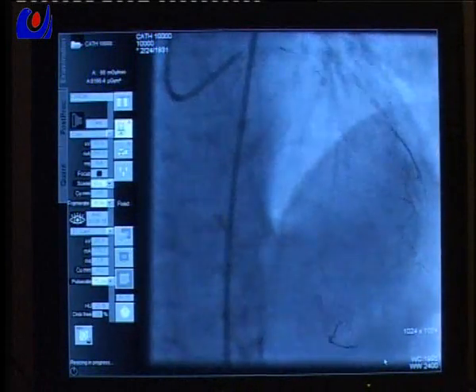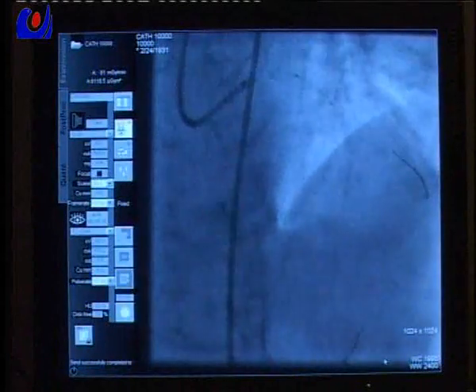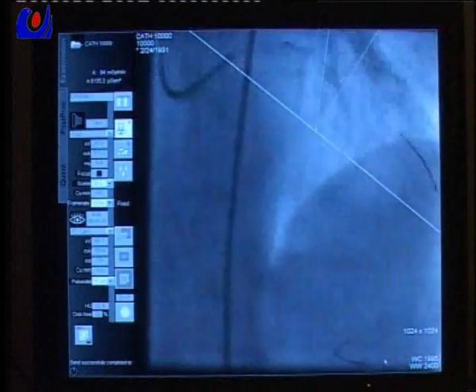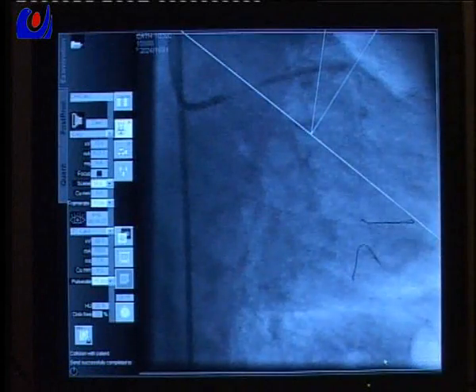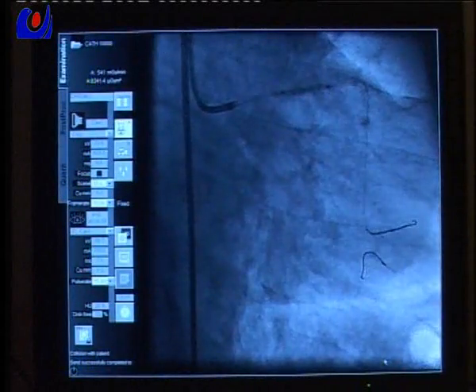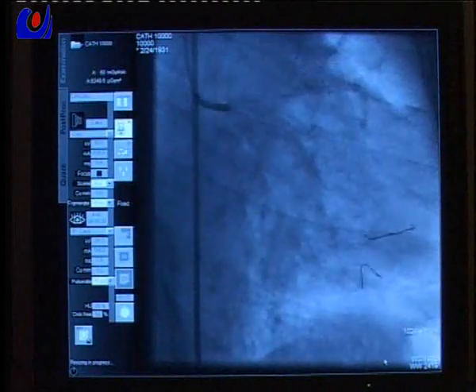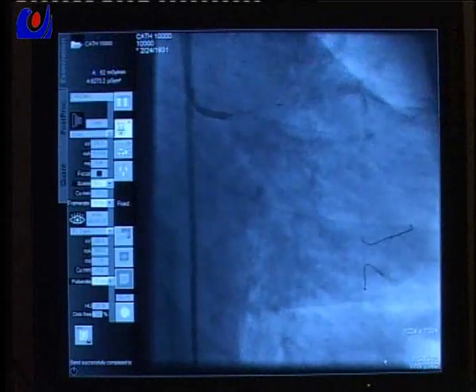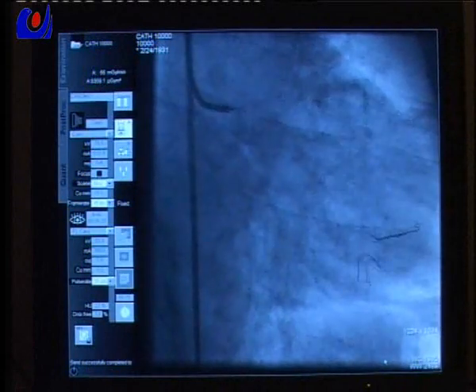Okay, here again. Yeah, I think we need to cover all the segment. Okay, dilate. Okay, 16. Yeah, 18. Continue. Go. 18. Right. Okay, done. All right. Okay, here. Okay, 18.